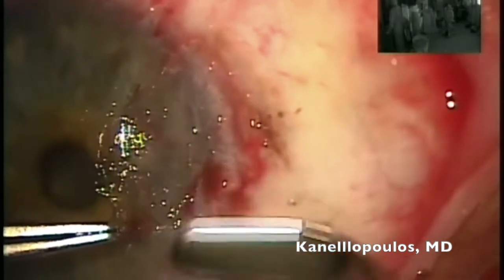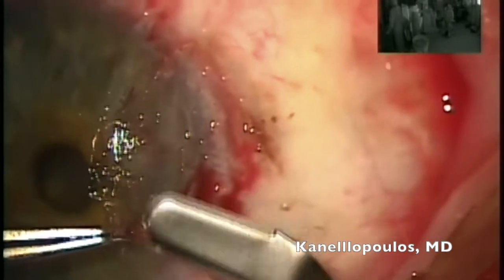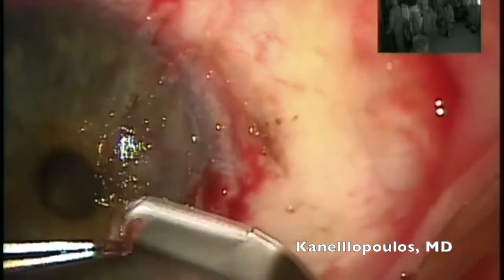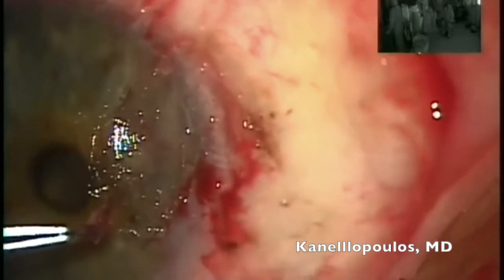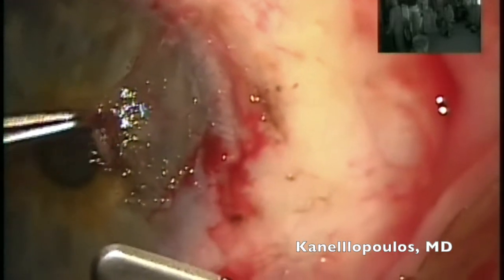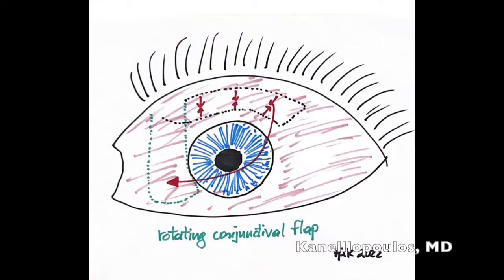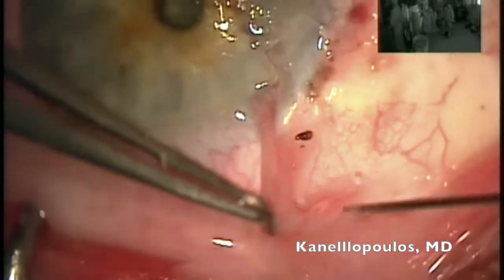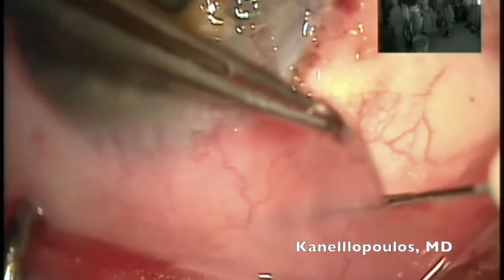Very careful here — it's very easy with this maneuver with my crescent blade to end up in the anterior chamber, which is definitely not our aim. Now we're going to cover that deficit with a rotating flap of conjunctiva that we're going to harvest from the superior aspect of the eye.